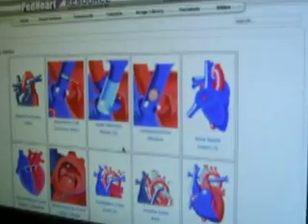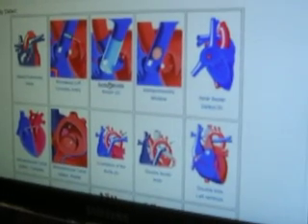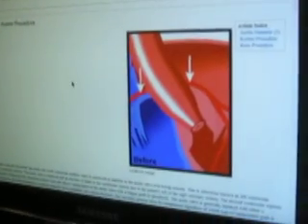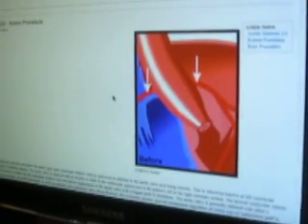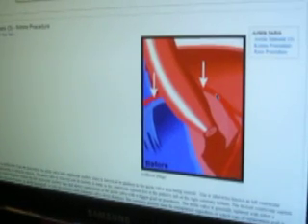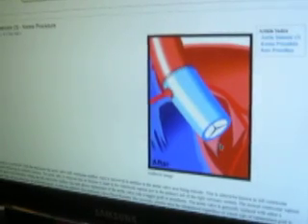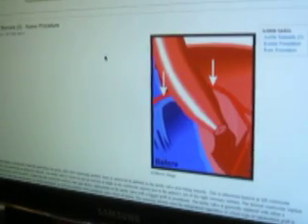So when we look at it that way, for instance, if we want to look at aortic stenosis, we will see that we have a discussion of a balloon valvuloplasty with animations that show exactly how that works. We also have discussions of other procedures, including a Konno procedure, where you have a resection of the muscle below and placement of a homograft.